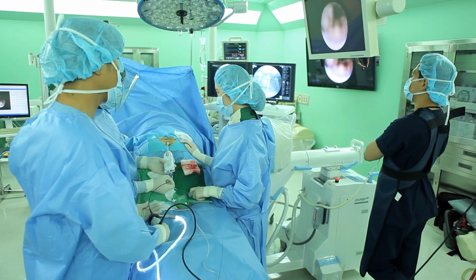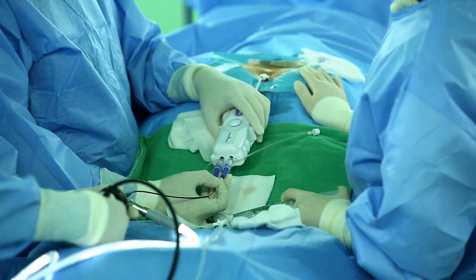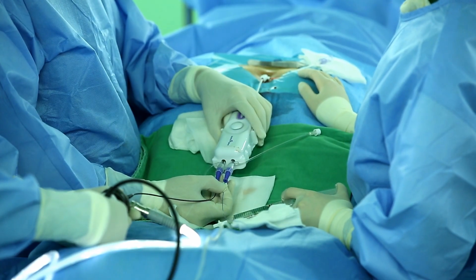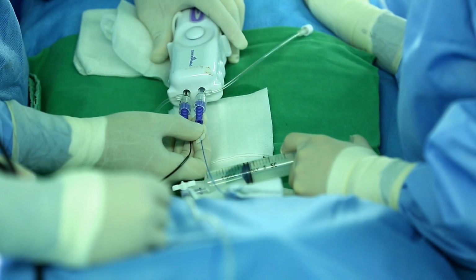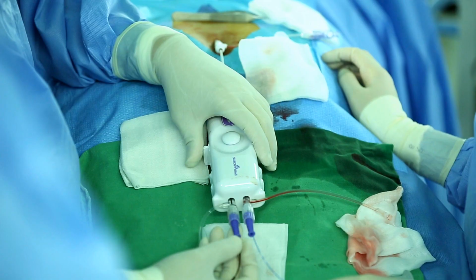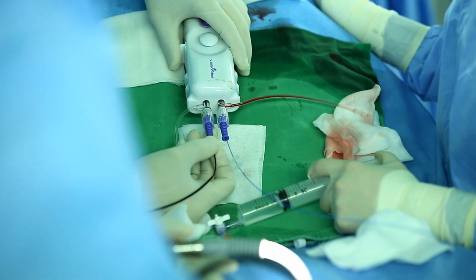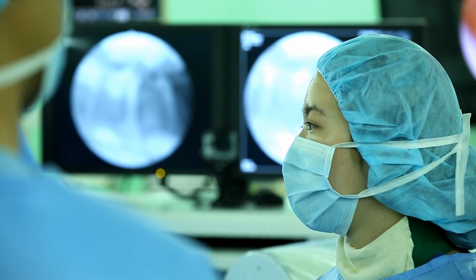While you are in the laser treatment, you keep injecting saline to see clearly. However, the patients appeal severe pain and want to stop this procedure. What can you do? SELD needs more or less 200 cc saline, but it may exceed 500 cc in doing multi-levels. You are requested to use the minimum saline to keep a proper level of view and cool down the heat from the laser ablation, which may damage the nerve.